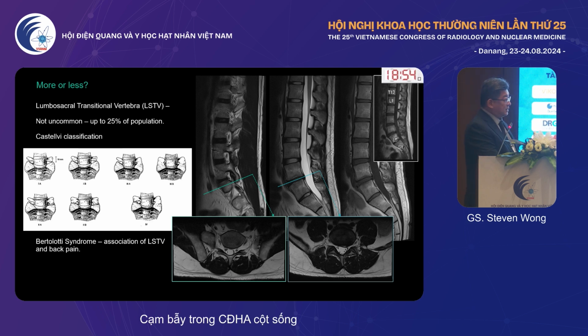The clue on the axial is that you have a large bony mass on the lateral aspect of the vertebral body and it is enclosing the anterior neuroaxial canal. And this can be the one that's causing the nerve root impingement also.